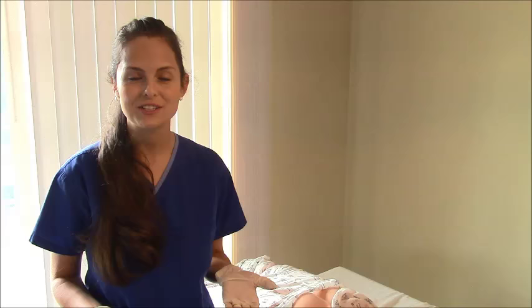Hey everyone, this is Sarah with RegisterNurseRN.com and today I want to show you how to give an injection in the dorsogluteal muscle. This is another type of IM injection. In my previous videos I showed you how to give an IM injection in the deltoid and the ventrogluteal, so this one we're going to do the dorsogluteal.